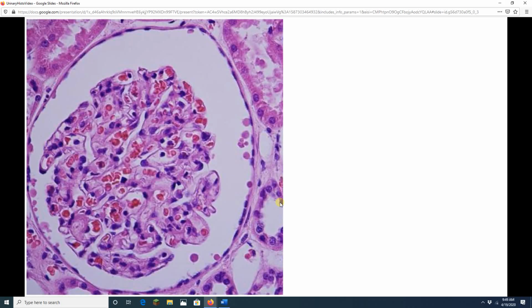Biology. So we're going to do a quick one on some of the histology of kidneys, urinary bladder, ureter, urethra, all that good stuff. And what we're starting out with here is a look at the cortex of the kidney. So we got the cortex of the kidney right here.